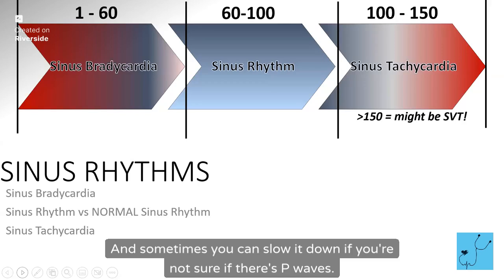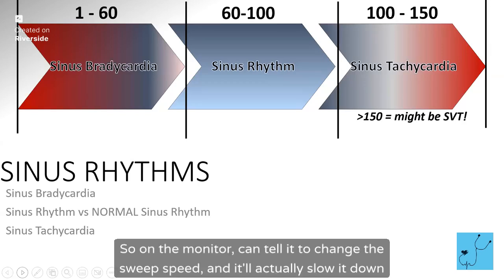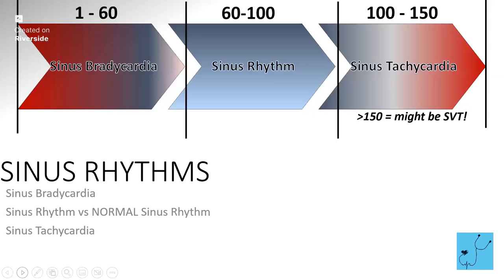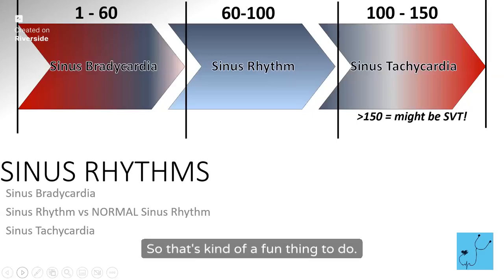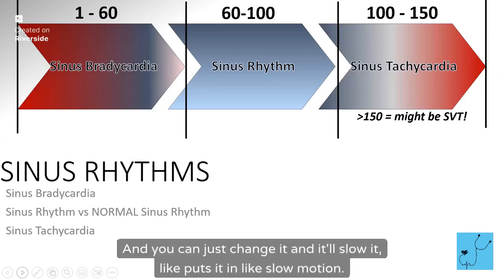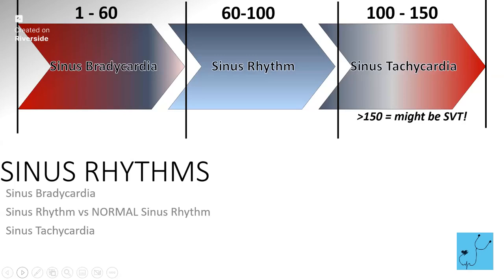Sometimes you can slow it down if you're not sure if there's P waves. On the monitor, you can tell it to change the sweep speed, and it'll slow it down and stretch it out. And then you can see if there's P waves. That's kind of a fun thing to do. You go into the settings, I want to say monitor setup, and it's called the sweep speed. You can just change it and it puts it in like slow motion.